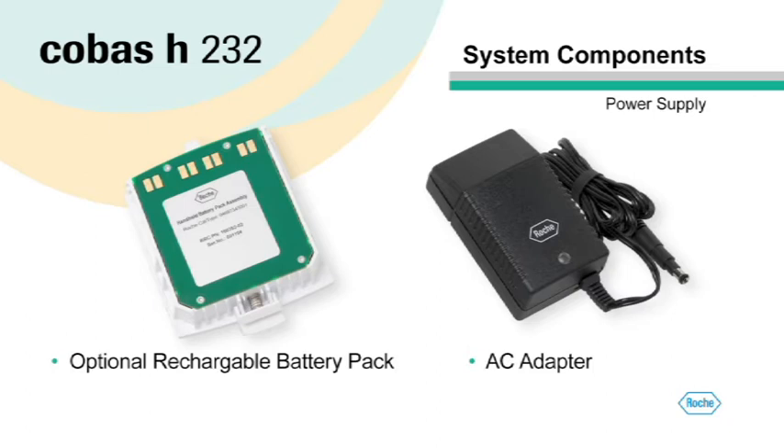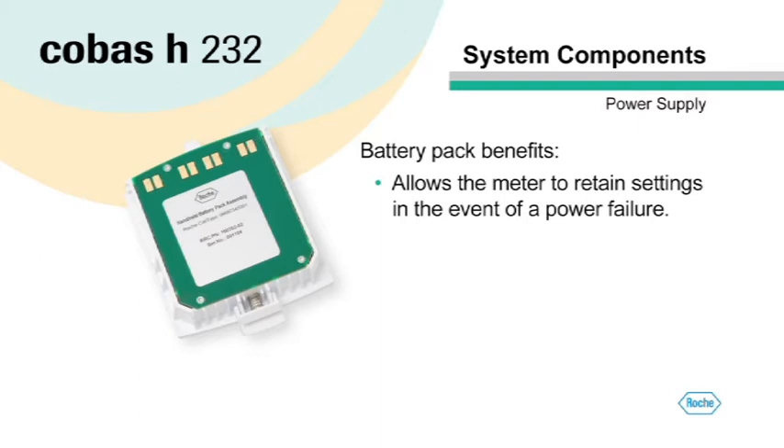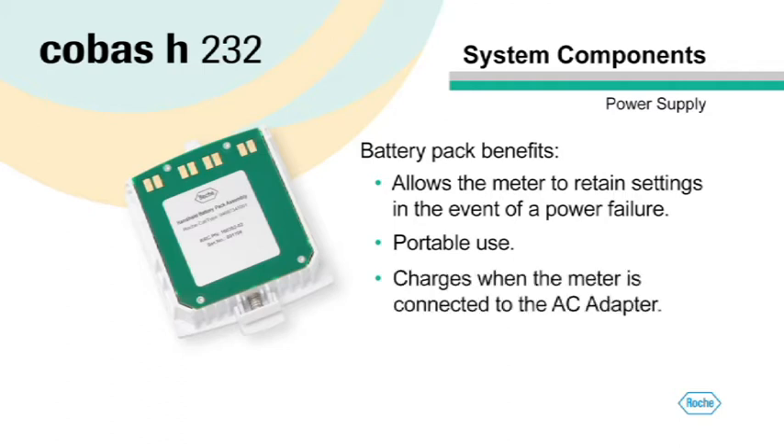The Cobas H232 meter can be powered either by the AC adapter or an optional rechargeable battery pack. The battery pack allows the meter to retain date and time settings in the event of a power interruption. All test results and operator and supervisor settings are saved in memory without a battery pack in place. The battery pack also allows for convenient portability in daily use and is recharged when the meter is connected to the AC adapter. While charging, you can operate the meter normally.